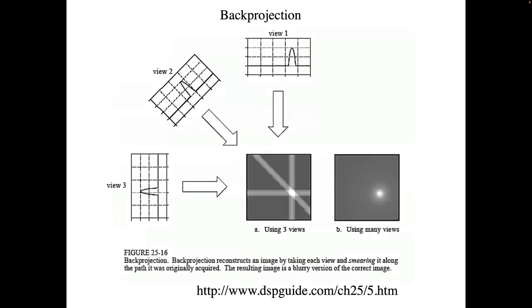Okay. So here we are. We've got our version of the disk in the plane, which is a blurred thing with a peak and a bad background. So here, this is a really cool animation. This is a back projection of intensities, those G one-dimensional intensities through a human head at one angle.